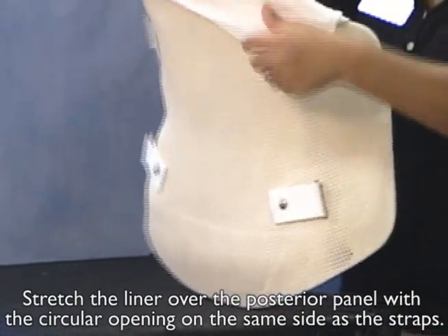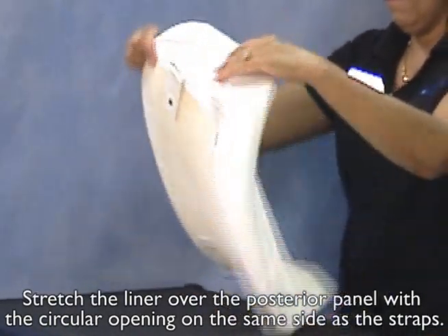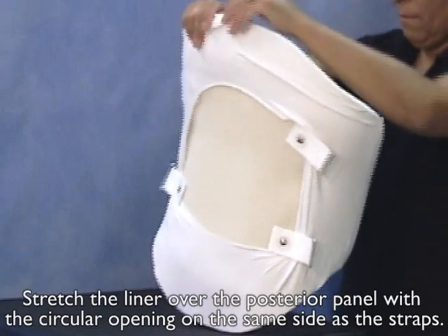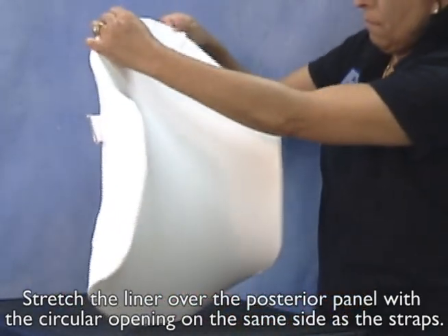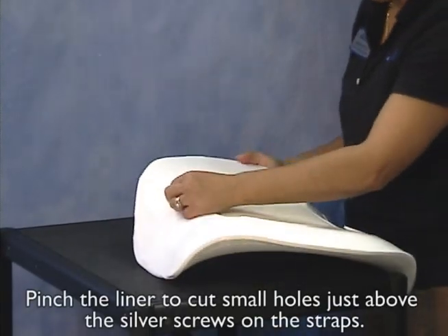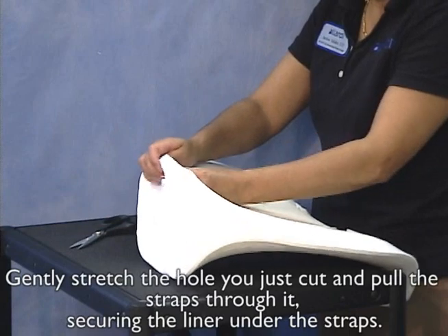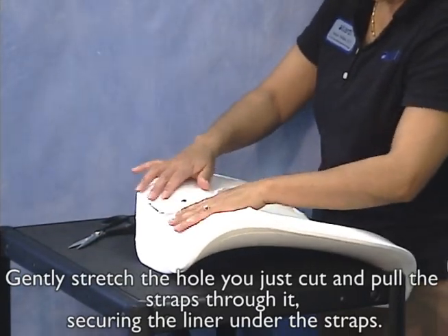Stretch the liner over the posterior panel with the circular opening on the same side as the straps. Pinch the liner to cut small holes just above the silver screws on the straps. Gently stretch the hole you just cut and pull the straps through it, securing the liner under the straps.